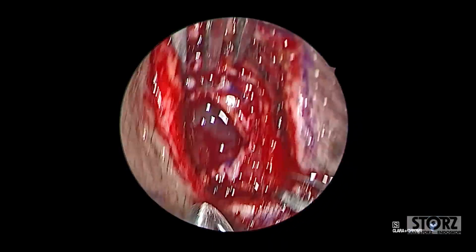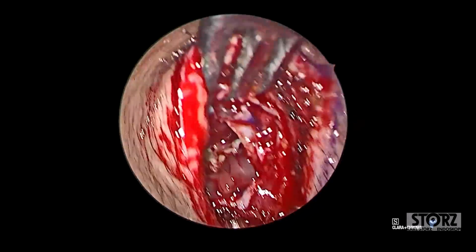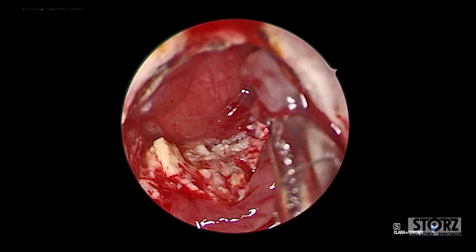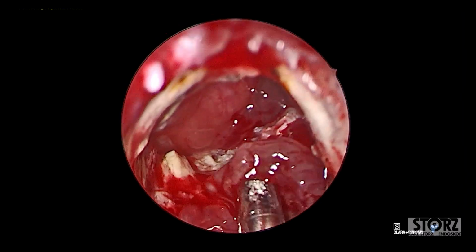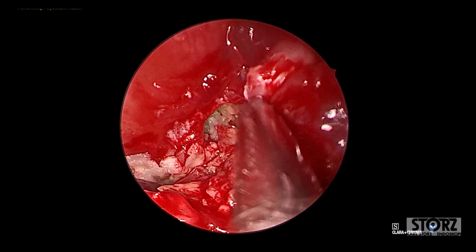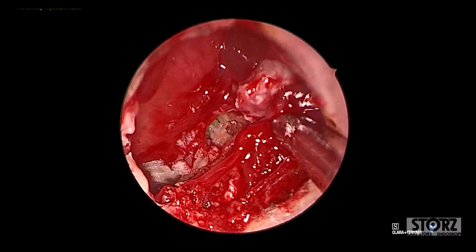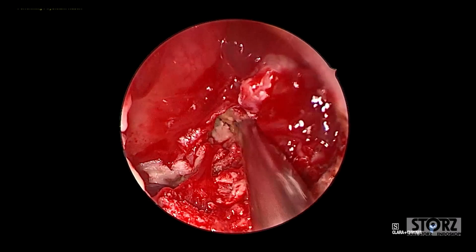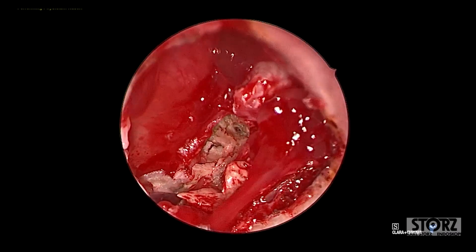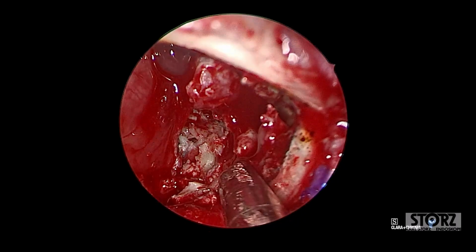This is a modified brow incision that allowed us to create a customized tailored window in order to access the lateral aspect of the frontal sinus. The edges of the cut are so sharp, it's similar to a 15 blade, but on the bone. This allows us to avoid using any hardware at the end for the closure.